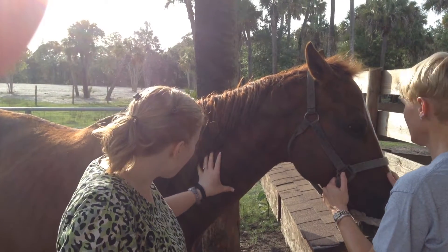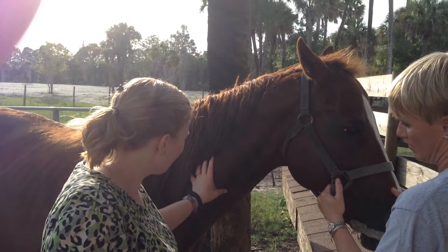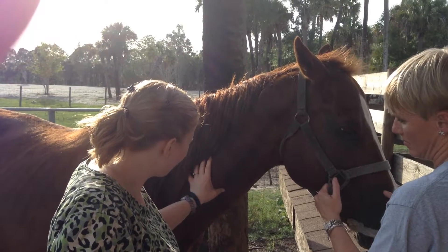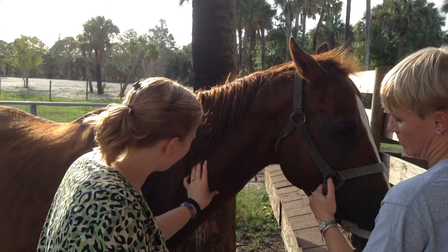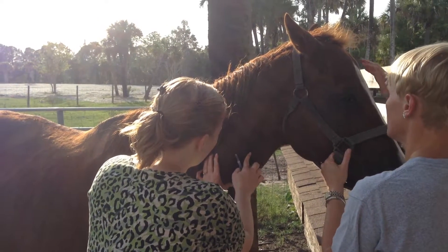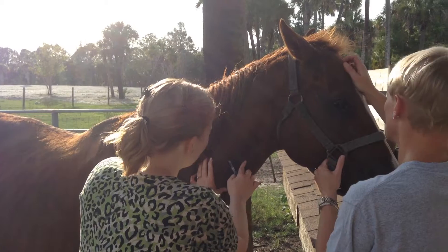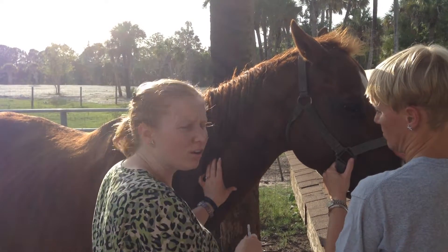I'm going to start by occluding the vein so that it will fill for me. I can see and feel it filling right here. I'm going to aim for the proximal third of the jugular vein to avoid the carotid artery.